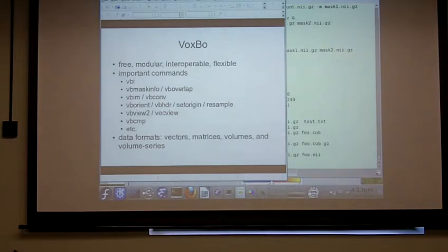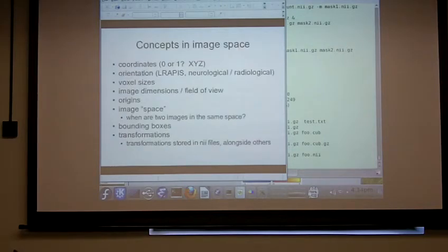I don't know whether this is related to my previous question, but the most frequently observed phenomenon that I had a while ago was when I load up an image in MRIcro, and then it looks fine to me, and then if I load the same image in MRIcron, then only the Y direction is kind of reversed.